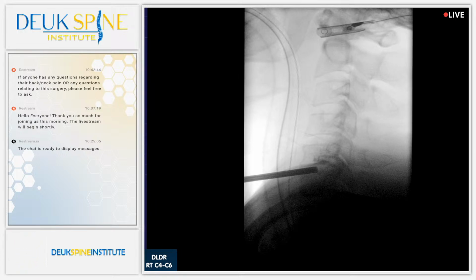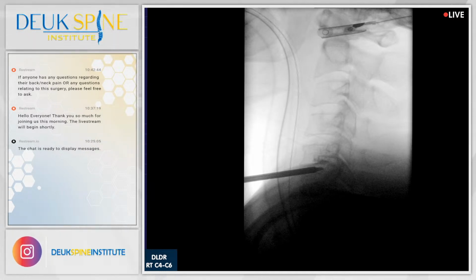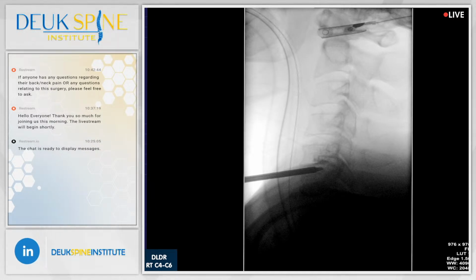Now, because the dilator came backwards, I have to set it again. And I will tell you this, if you don't reset the dilator, you're just going to biopsy the disc. We don't want to biopsy his disc. A biopsy is where we go in as a surgeon and we cut a hole in something with a tube to get a piece of tissue. We don't want that. We're not trying to biopsy anything.